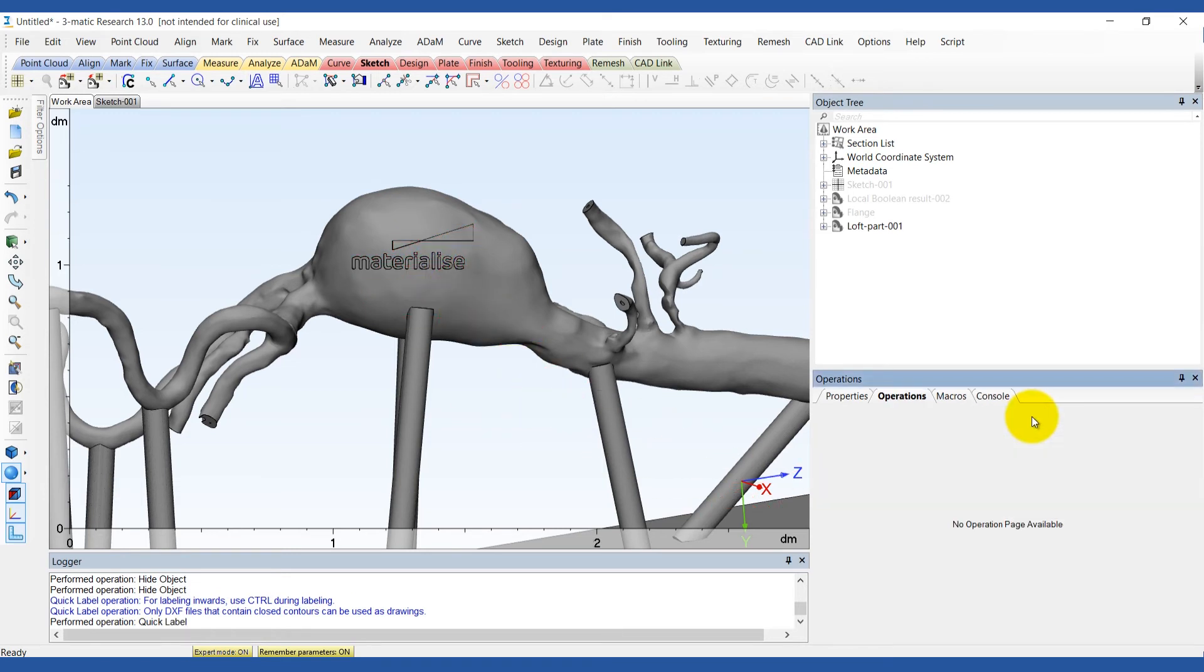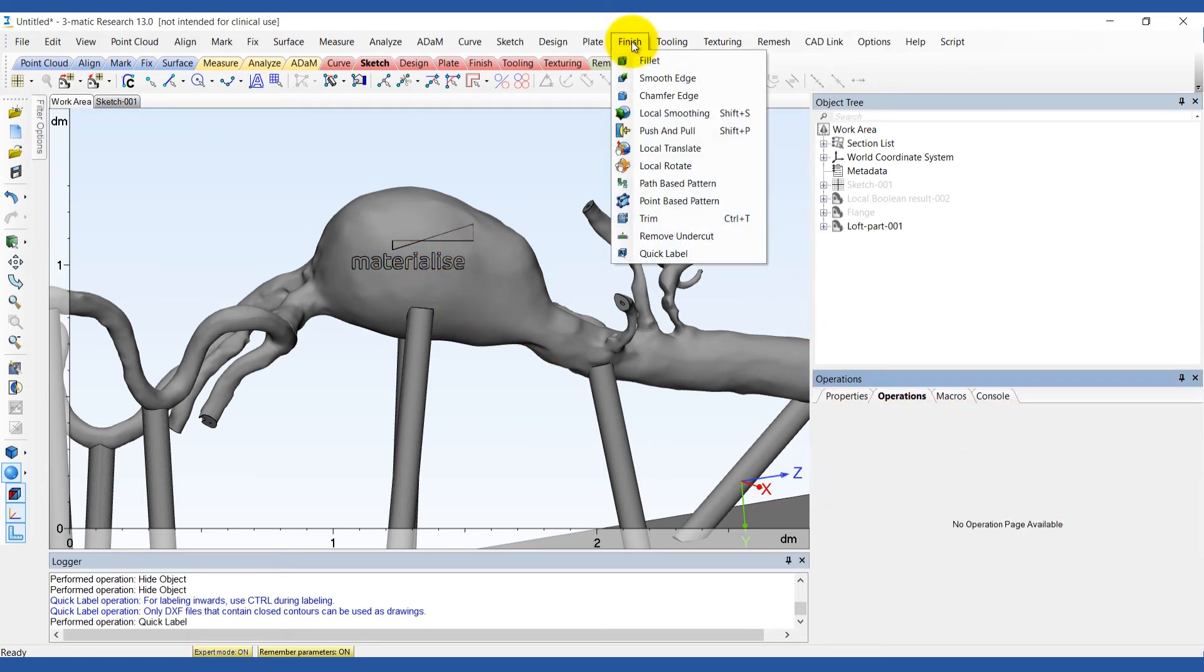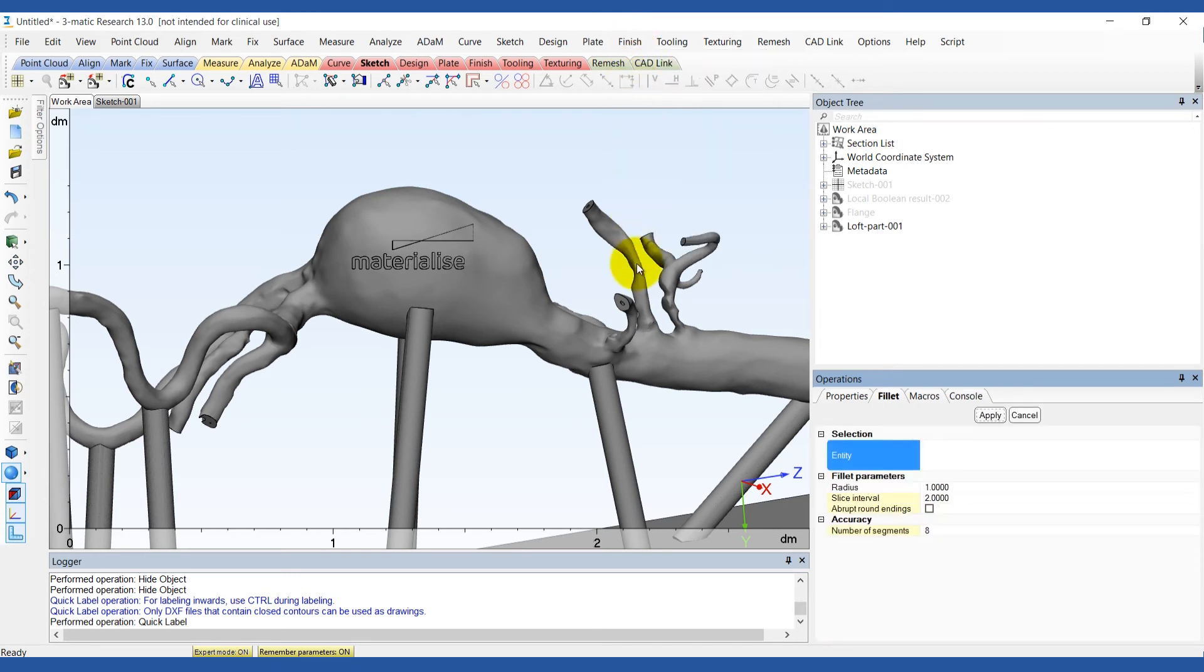Finally, to smooth the outer contour of the base, use the fillet tool under the finish menu with the radius of 1.